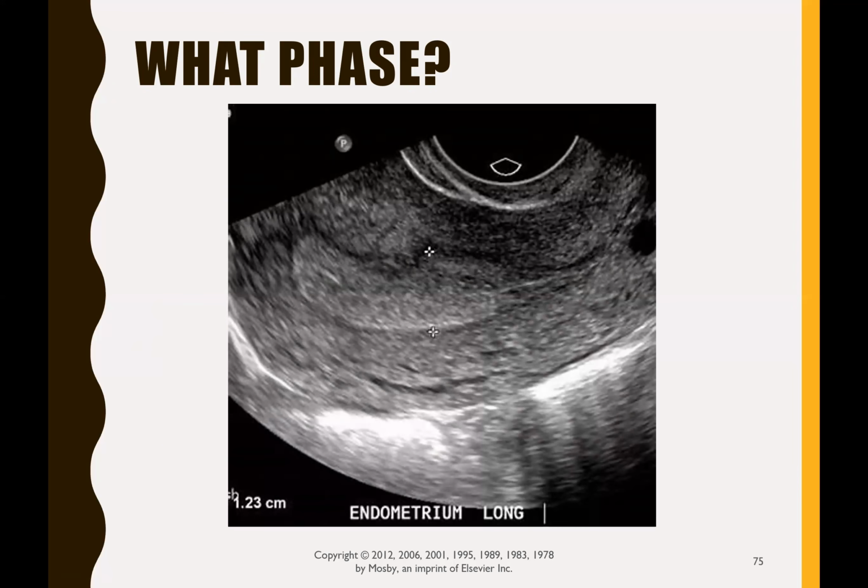What phase is this, guys? The secretory phase, you got it. See how nice and thick that is? 1.23 centimeters.